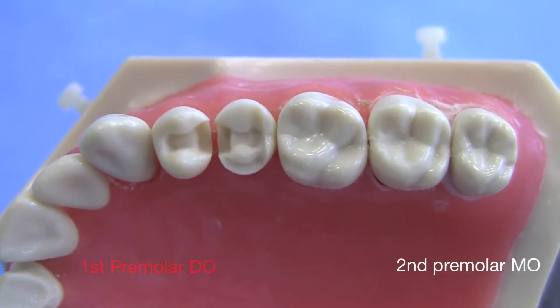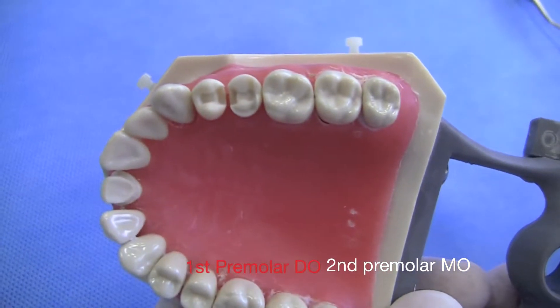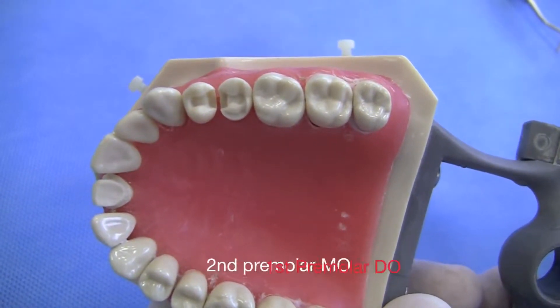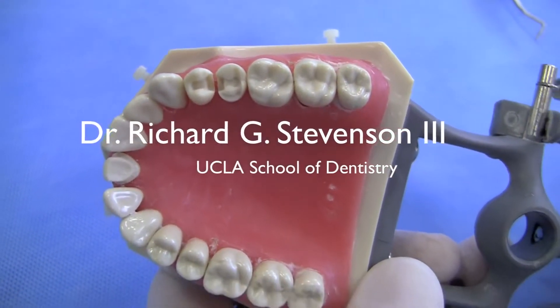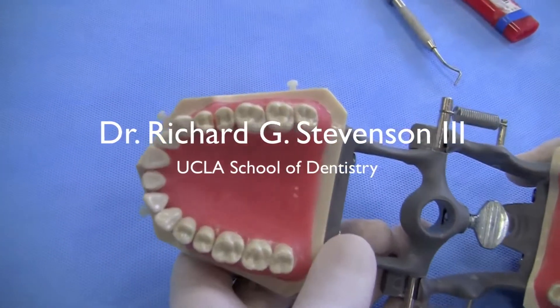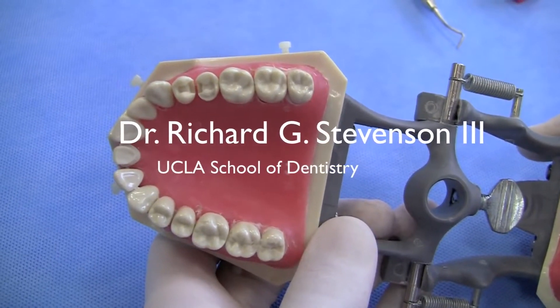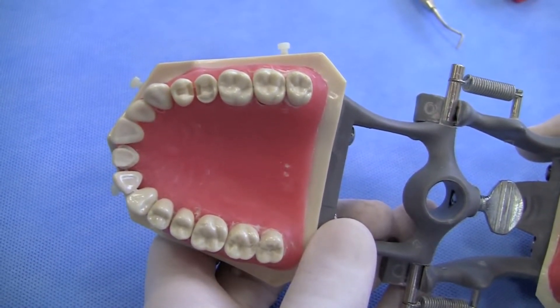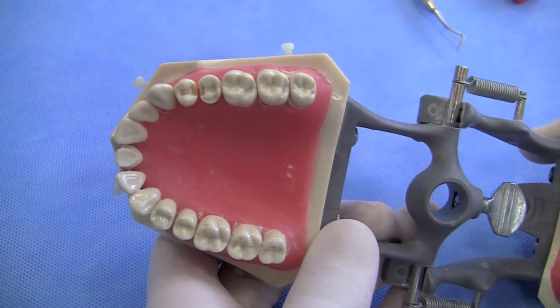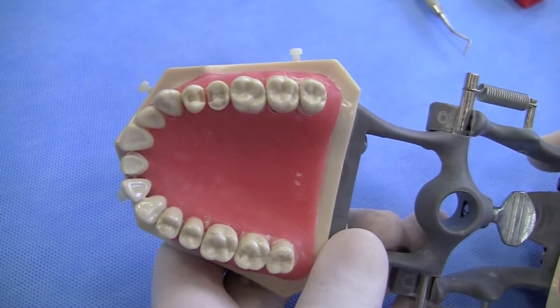In this case we have a couple of ceramic inlay preparations — a DO on one tooth and an MO inlay on the second premolar. The preparations are quite simple to do, as is the impression, but sometimes providing a provisional restoration can be a challenge. What we want to do today is show you a simple technique using a product that's been around in dentistry for a long time to accomplish this goal.